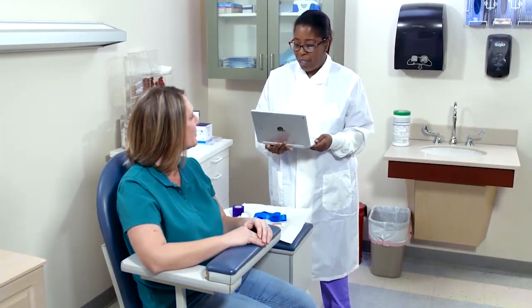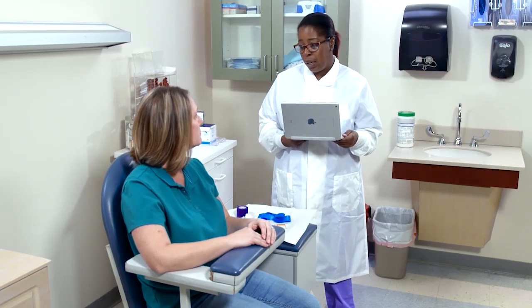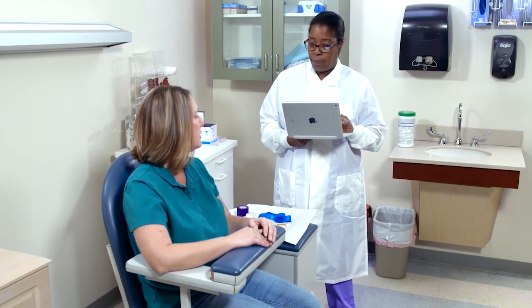Hello, Tina. How are you? Good. How are you? I'm good. My name is Tori. I am Dr. Anderson's medical assistant. If I could get your first and last name, please. It's Tina Lakin.